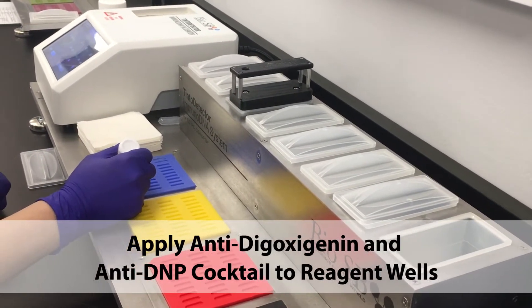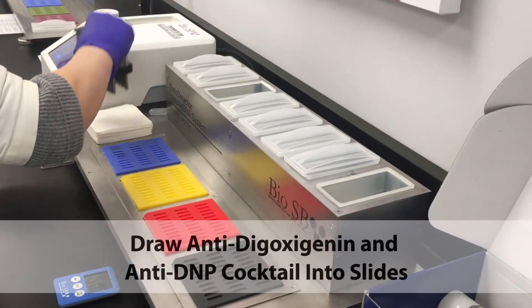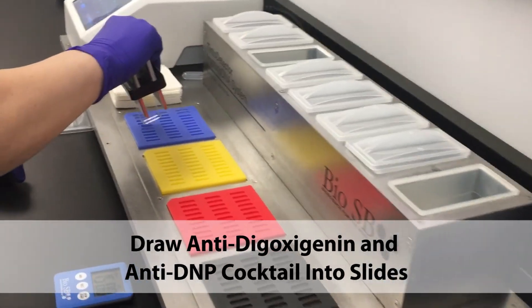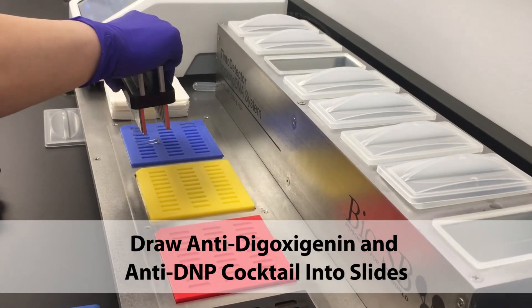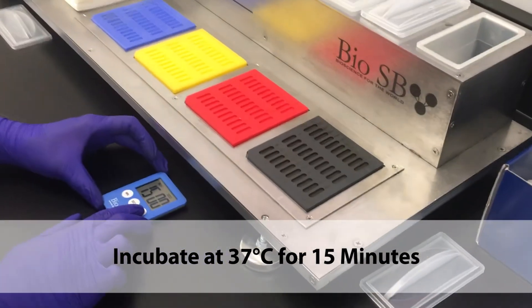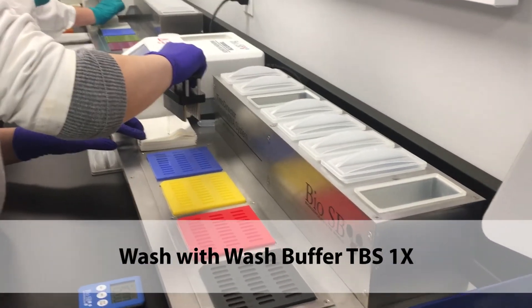Apply the anti-digoxygenin and anti-DNP cocktail to the reagent wells. Draw the anti-digoxygenin and anti-DNP cocktail into the slides and incubate at 37 degrees Celsius for 5 minutes. Wash with wash buffer.